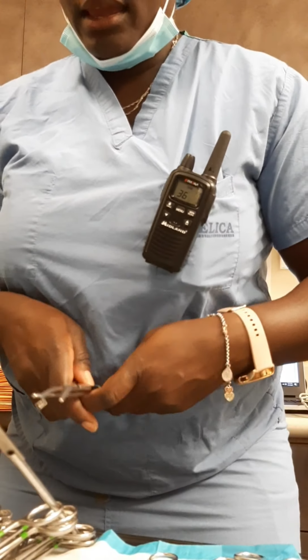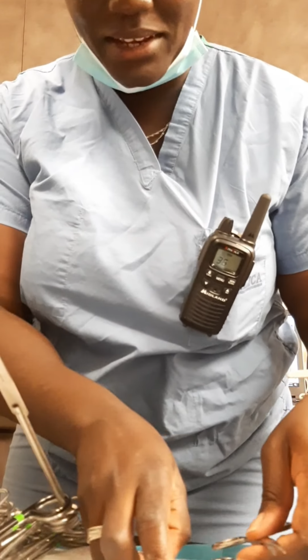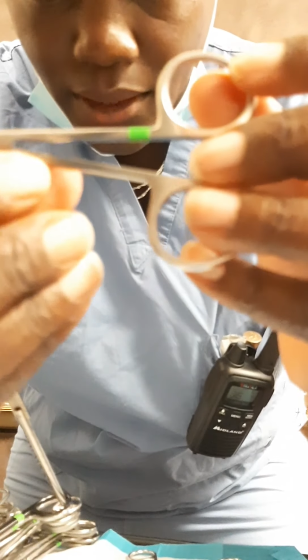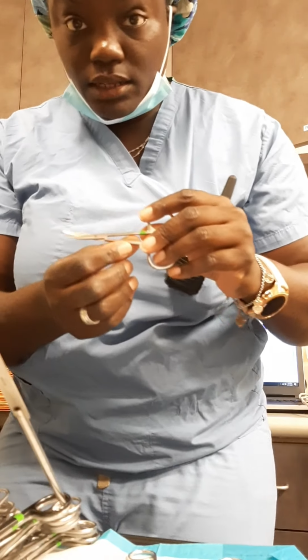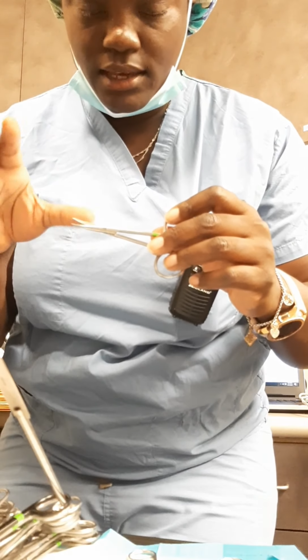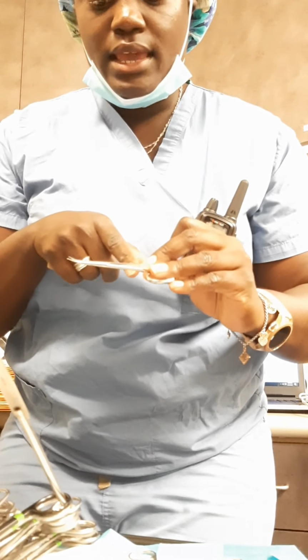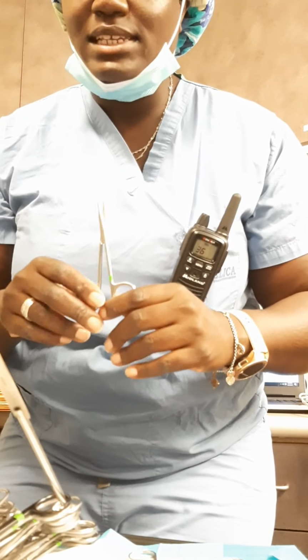Do I know all the names of each instrument? Not all of them. That would be too many. They are labeled by engravement from the company. So they have numbers on them that are the catalog numbers. And if you are in a facility that is really high tech, you will have a bar scan, and it'll be etched, and you will just scan it, and it will let you know if it goes in the set. There's so much advancement in this field. It's kind of crazy, but this is like the old school way of doing things, but it's okay.